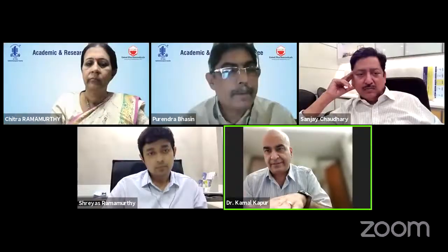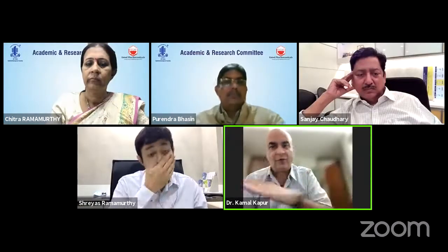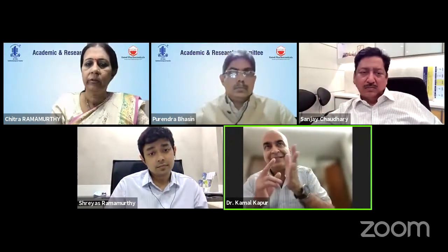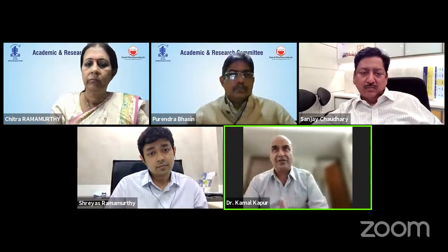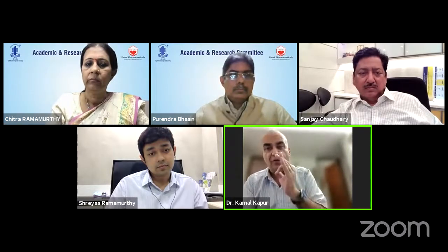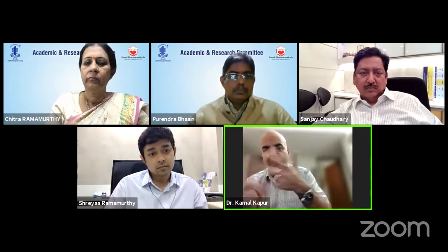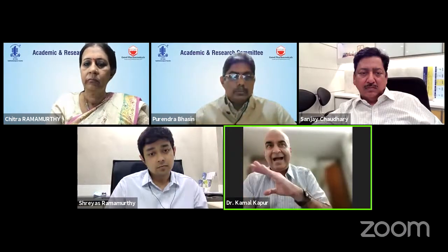Yeah, I think I would tend to agree with all the previous people, but also have my own take on it. Shallow vault, if it's a toric lens, I would explant it, because sooner or later it will rotate. Take it from me, sooner or later it will rotate. My second condition would be if I have a patient who I cannot keep on regular follow-up. Believe me, there could be patients like that. I would explant shallow vault. So toric IOLs and a patient who cannot be in a regular follow-up for a shallow vault, I would explant.